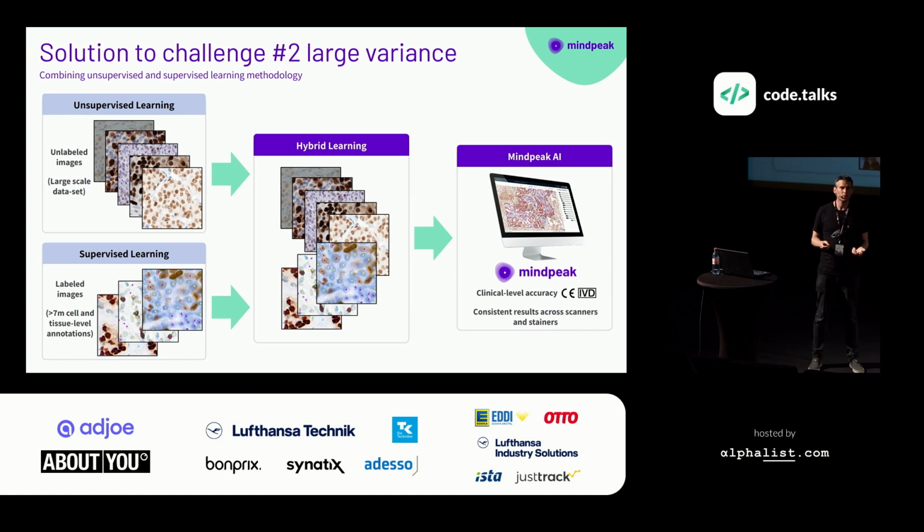So typically in deep learning, so who of you is training machine learning models, deep learning, anything like that? Couple, okay. So most often you do supervised learning where you have images and then labels for it. So kind of ground truth measures that doctors put on there. So these are the little colored dots here that I put there. Those would be our annotations.